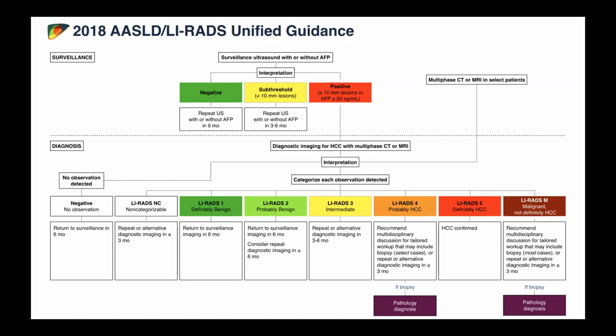Why I've put this slide up there is that we have spoken about surveillance and the role of ultrasound in surveillance itself. In a country like India, ultrasound is the best tool to serially monitor, or what you would call for patients to undergo surveillance. However, if you read literature, especially in the last 2 to 3 years, you are seeing a subtle change in momentum towards non-ultrasound techniques to be used in surveillance.